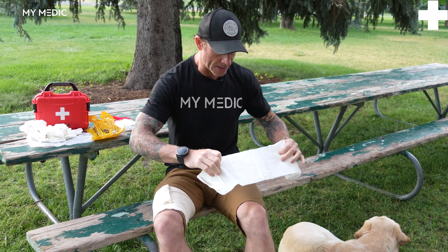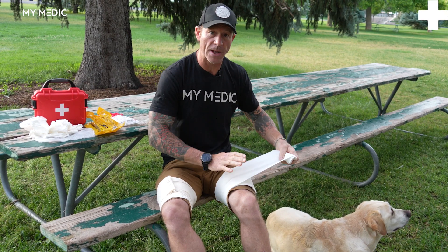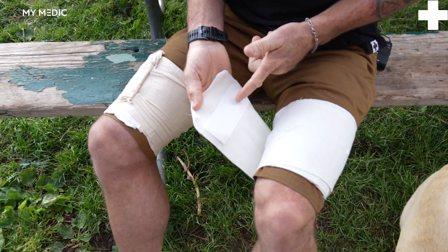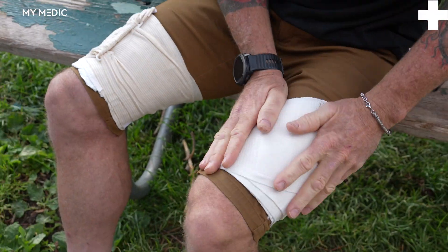Now let's go through the Mimetic. You do have the non-adherent section that is going to go directly over the top of the wound. Again, when you are doing a pressure dressing, you're going to stretch and then wrap — that's what gives you that good pressure. At the end of the Mimetic EPB, instead of the plastic clips like the Olias, it's just a large piece of Velcro. You slap it on and you're good to go.